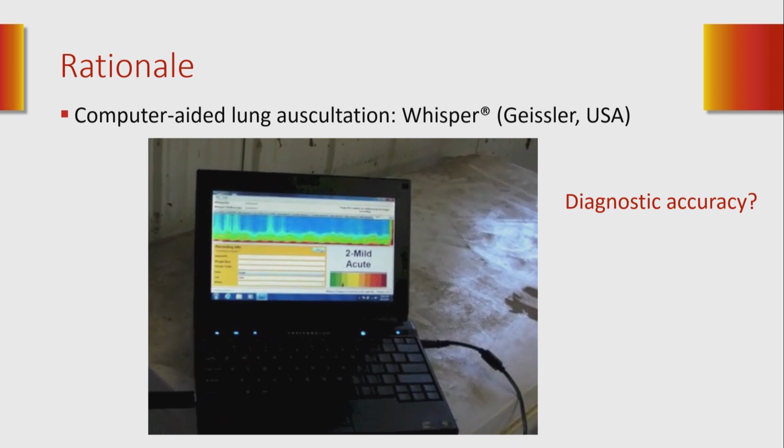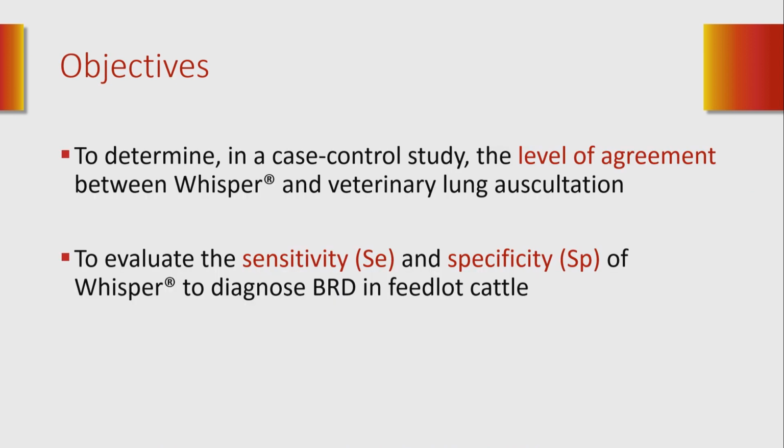So this system has the potential to significantly improve the accuracy of BRD diagnosis in feedlots. However, as Dr. Constable just mentioned, its accuracy needs to be evaluated by a third party. This is why we did this study: to determine, in a case control study, the level of agreement between the Whisper and the veterinary auscultation, and also to determine the sensitivity and specificity of the Whisper to diagnose bovine respiratory disease in feedlot cattle.